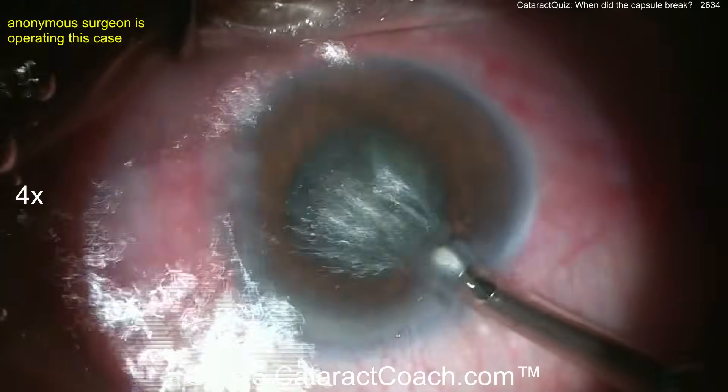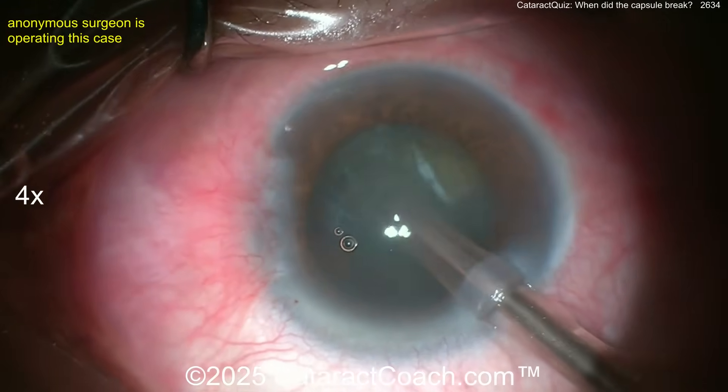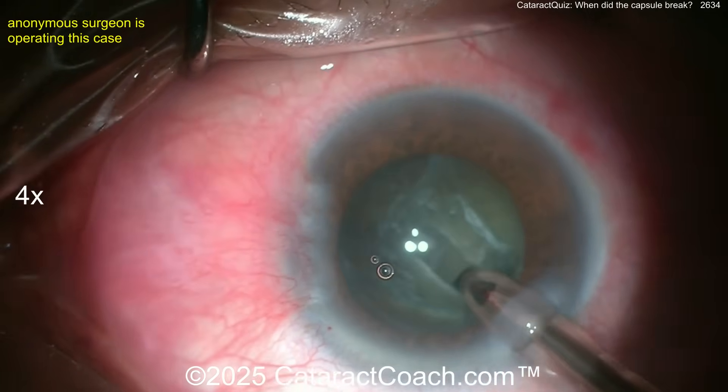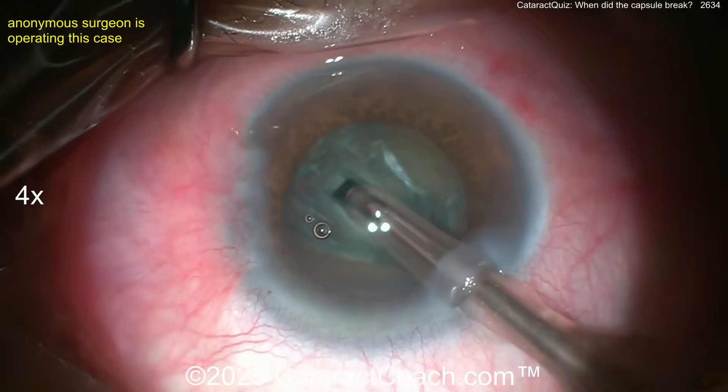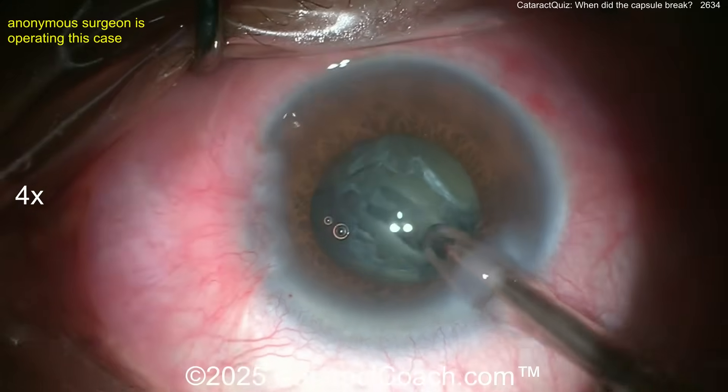Now the pupil is a little bit smaller, and we pretty much know the capsule is open — but to what extent, we don't know. Here comes a groove down the middle. Looks like a stop-and-chop technique. Watch carefully for when you'll notice a ruptured capsule.